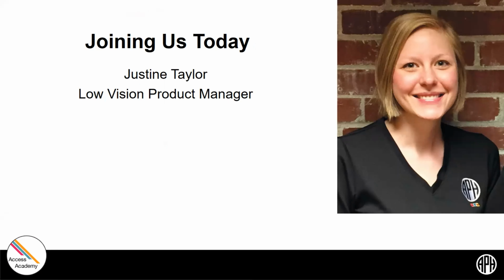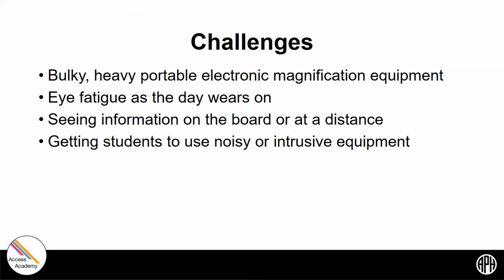Let's talk about some challenges that you might face or that your students might face. Sometimes magnifying equipment is heavy, bulky, hard to move around, and not portable. Sometimes you deal with eye fatigue during the day that makes it difficult to use magnifiers.